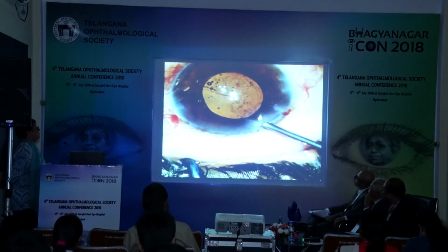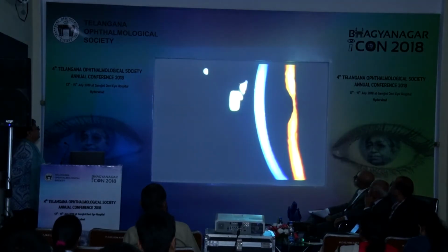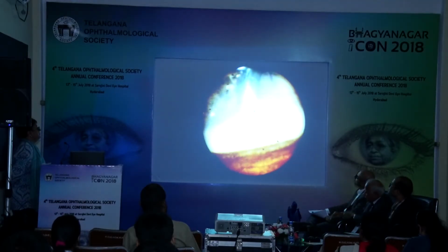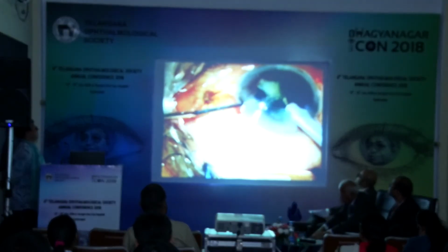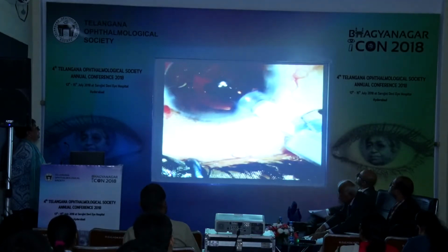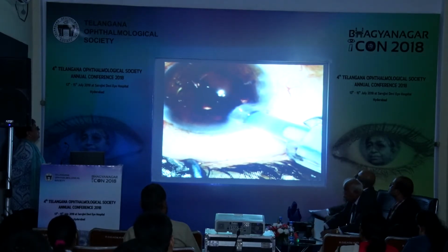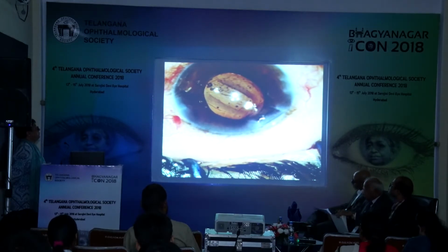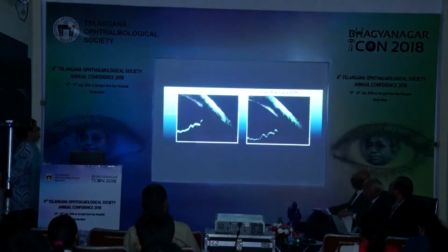Currently, no treatment definitively addresses angle closure glaucoma secondary to plateau iris syndrome. Our preliminary results suggest that endocycloplasty in combination with phacoemulsification and an IOL implantation directly impacts this underlying morphological anomaly. Anterior segment OCT provides direct evidence of this.